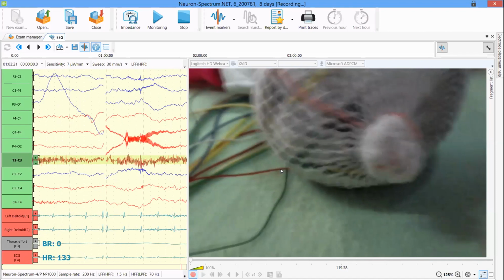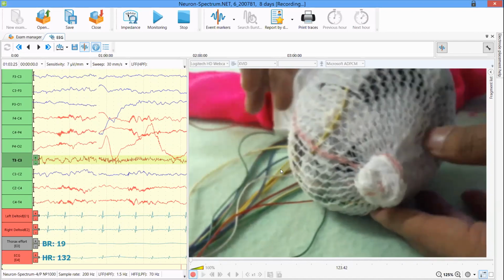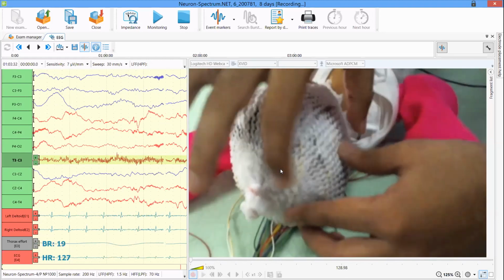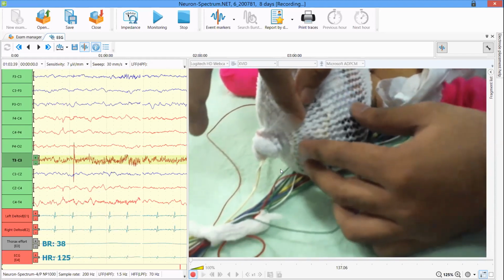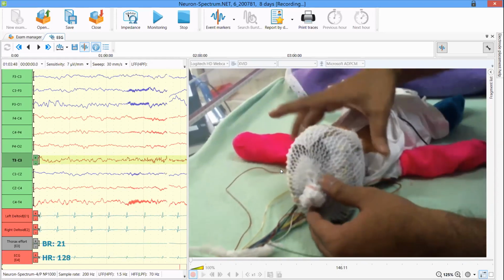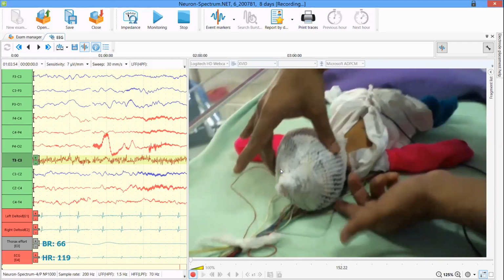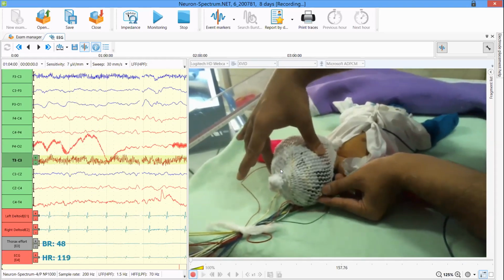The most central area is CZ, and just above the ear, on the left side it will be T3 and on the right side T4. As discussed, first we place the CZ, then we put the T3 and T4. In the middle of these two, on the right side it will be C4, and on the left side C3. So we'll have an arch already formed, with the ground here and CZ. After that, we go to the back and find the inion, and just above the inion there is the OZ, and as discussed, on the right and left we have O1 and O2.